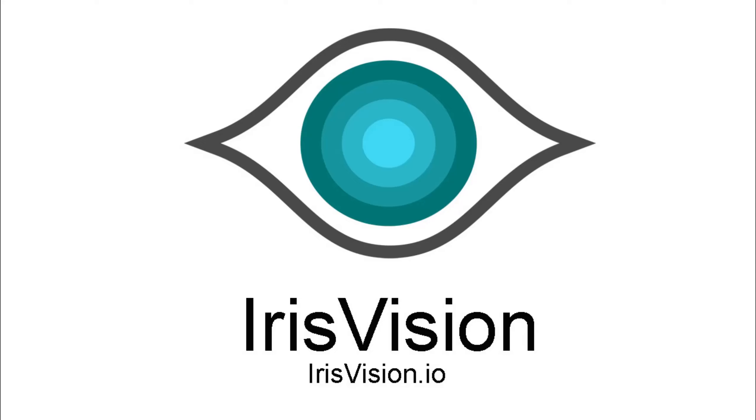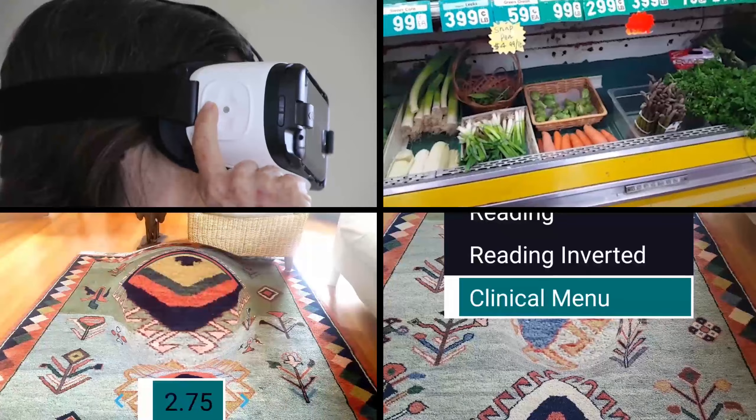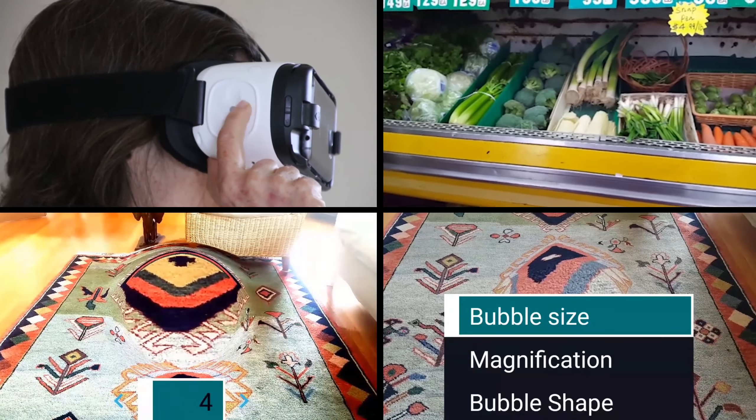IrisVision offers a low-cost, high-functional visual aid which enhances the lives of people suffering from low vision. IrisVision is built from a virtual reality technology platform that is already deployed all over the world. Virtual reality takes people out of the real world, where IrisVision uses the same type of virtual reality platform to allow low vision patients to interact with the real visual world. This video shows how IrisVision works and how to control its many functions.